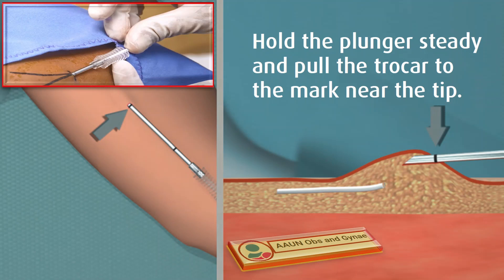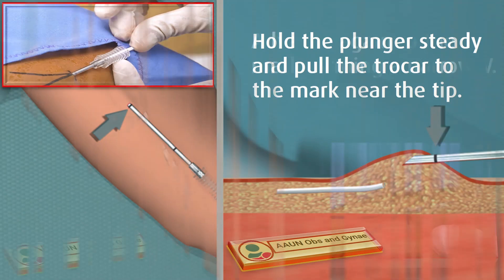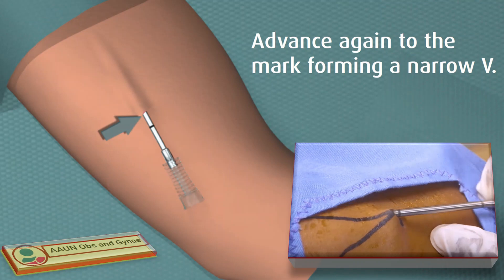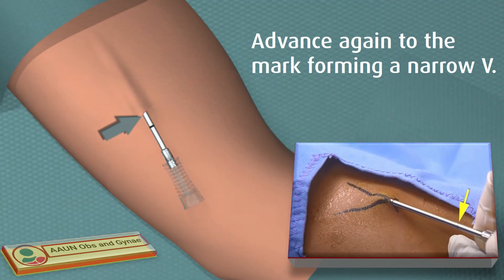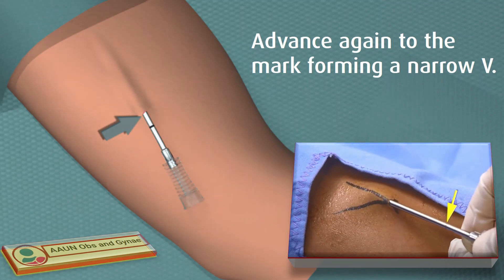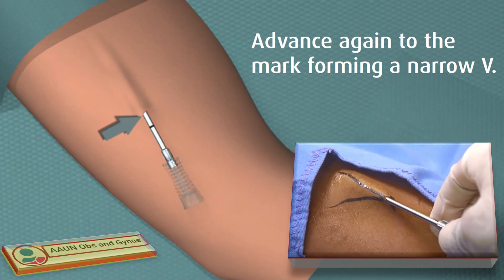When you can see the mark near the tip of the trocar in the incision, the implant has been released and will remain in place beneath the skin. You can check this by palpation. After confirming the first implant is in place, get ready for the insertion of the second implant.